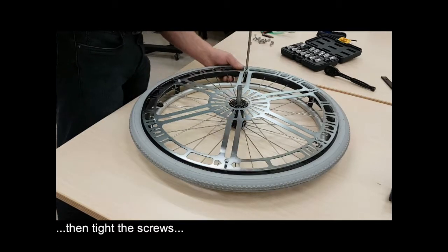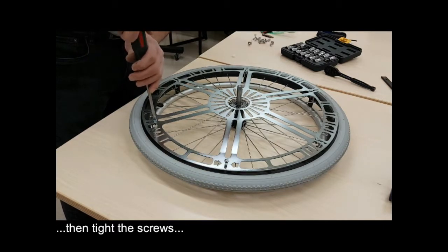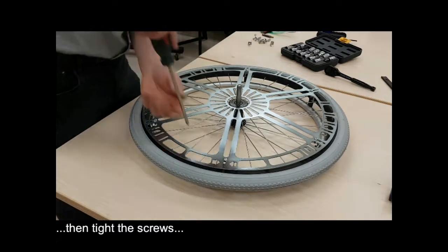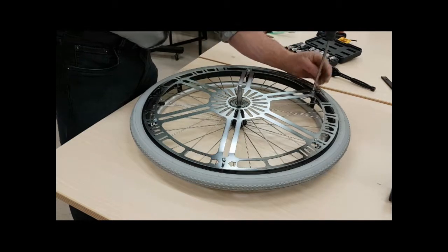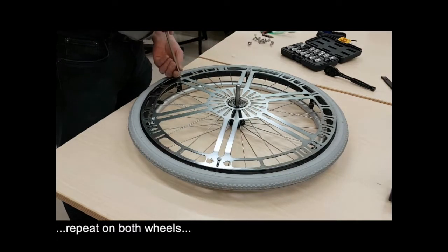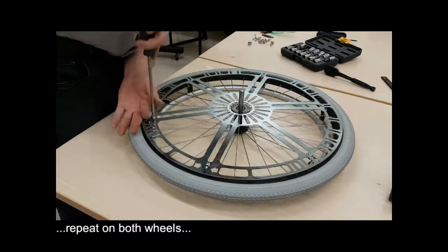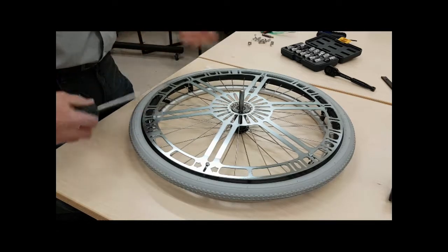Make sure that you screw all the screws. Okay, and then we go back on each screw, making sure they are tight enough. And the last one, and that's it. And then we repeat the same procedure with the other side, the other wheel, and this is step 1.